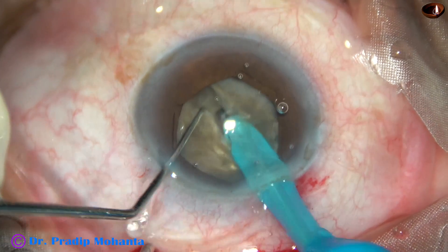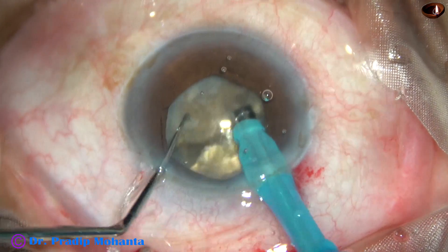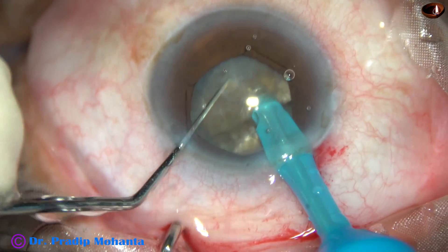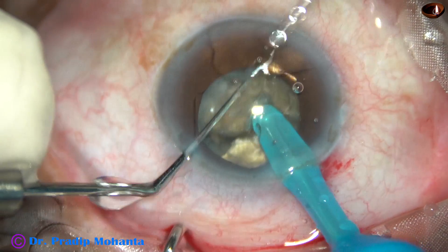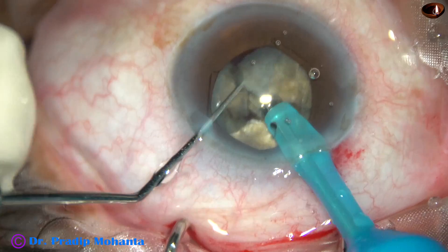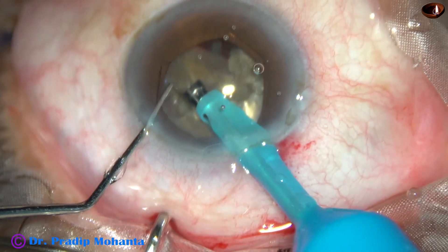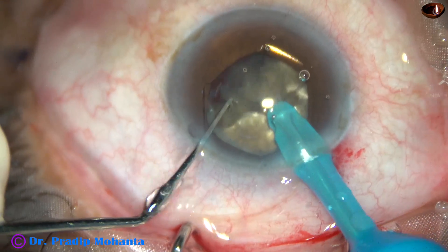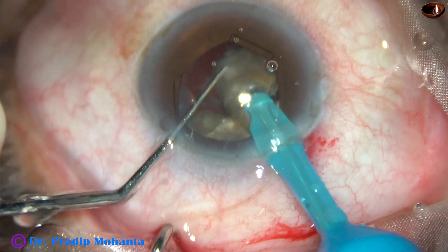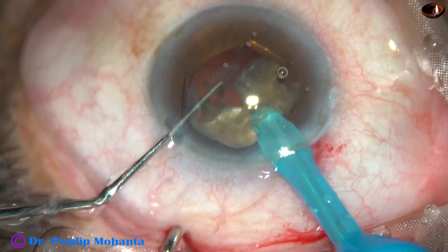It has been rotated 180 degrees. One hemi-nucleus is held and then the chopper is used to divide and separate the two hemi-nuclei completely. And now each hemi-nucleus is being divided into three fragments. This is one, and this larger fragment is again divided — thus the hemi-nucleus gets divided into three pieces. Now I am going to emulsify these pieces; one hemi-nucleus has been emulsified completely before dividing the other hemi-nucleus.